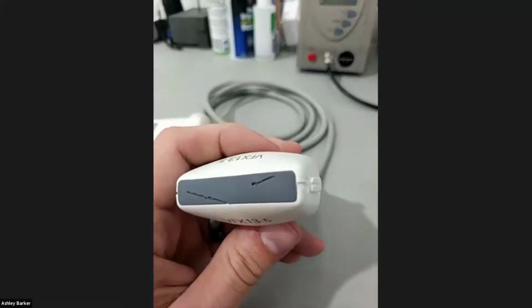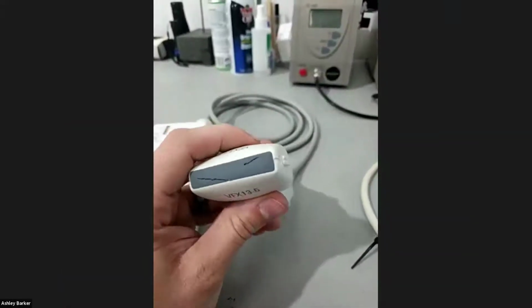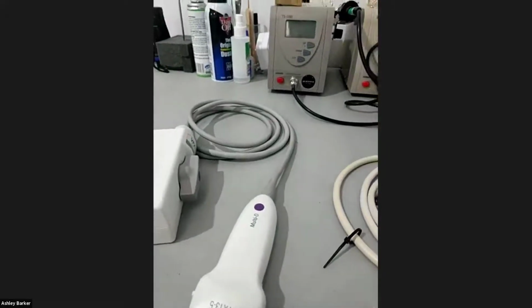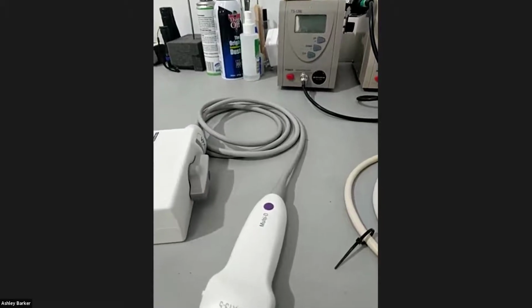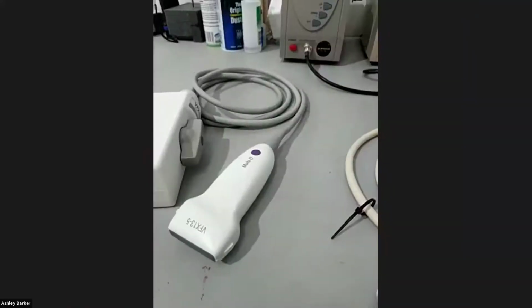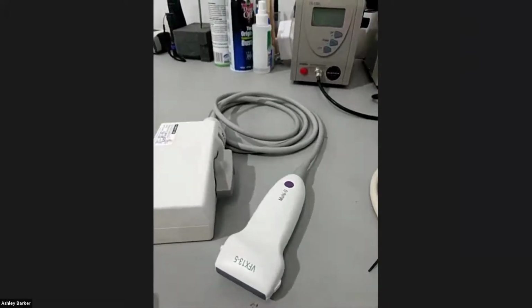But if it's crystals out, so you've got lines in the screen, that means it's gone deeper. That means it's more expensive. Would that be correct? If it's actually damaged the crystals, then yeah, it's definitely going to be more expensive than that. And at that point, it may or may not be repairable. It depends whether an array is available for that particular probe. Because sometimes you might be better off buying a second-hand probe than trying to repair the one that's already damaged. I suppose a bit like writing off a car in a way, isn't it? Yeah, I mean, it is. Again, it's probe dependent, and it depends what damage is there. We're able to assess that, and we're also able to advise you on whether that's a sensible thing or not.